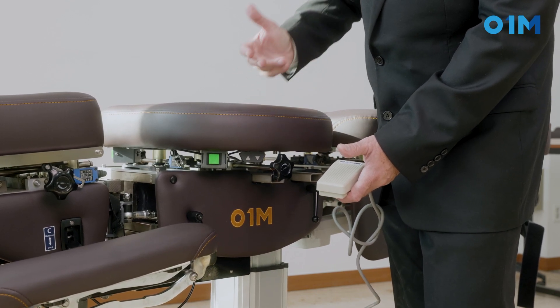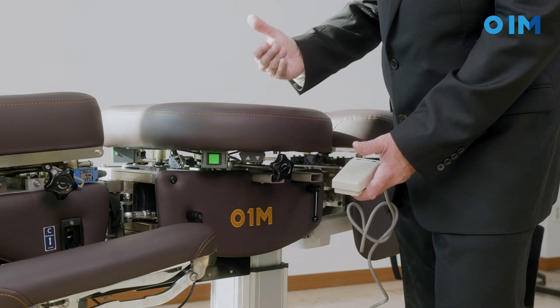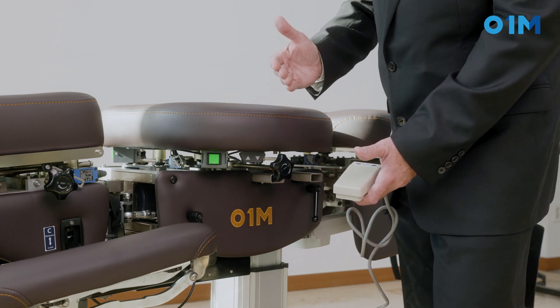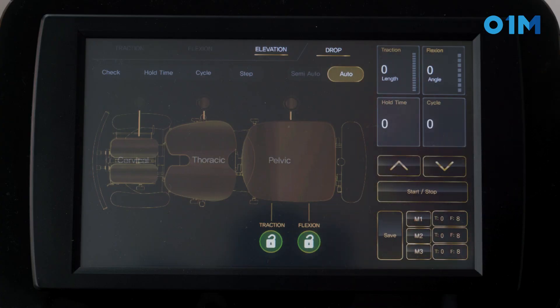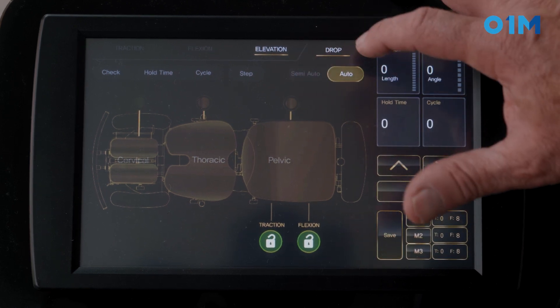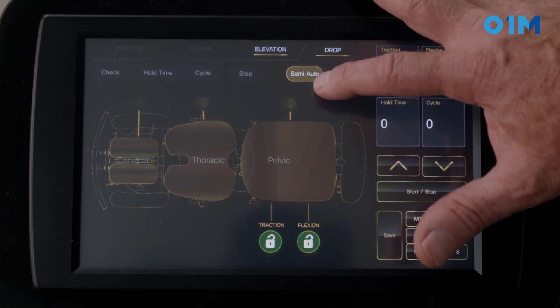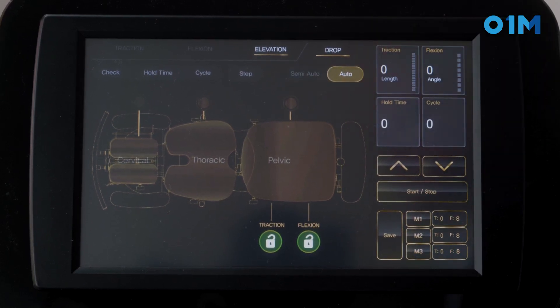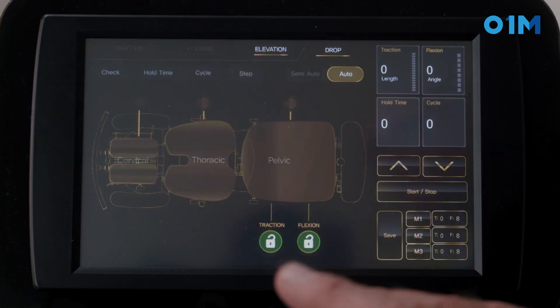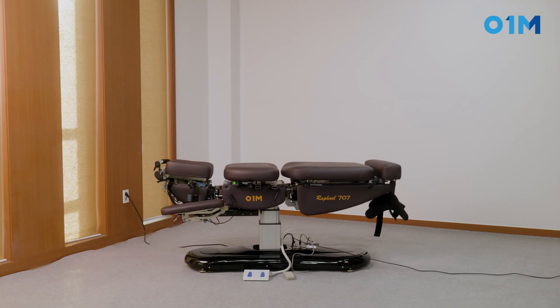The advantage of automatic mode is that you can use a repetitive drop without manually triggering it. You can trigger any drop from the screen. We have two options for the drop: first we select the drop, then we can put it in non-automatic or automatic. Let's start with the automatic section — I put the drop very light, and if I click on the pelvis you will see the automatic drop on the pelvis.